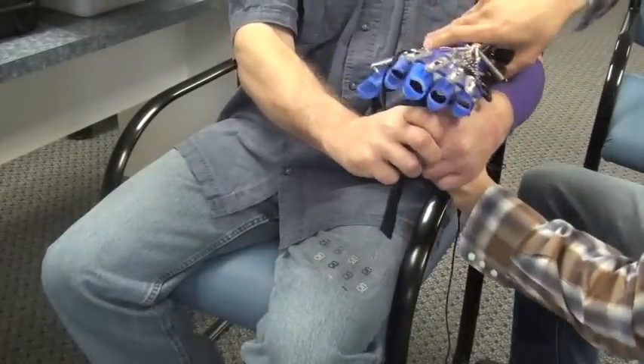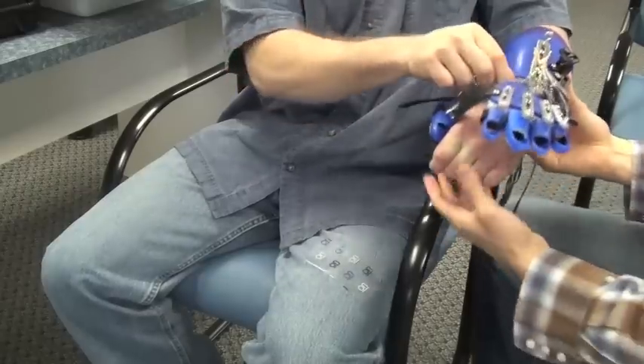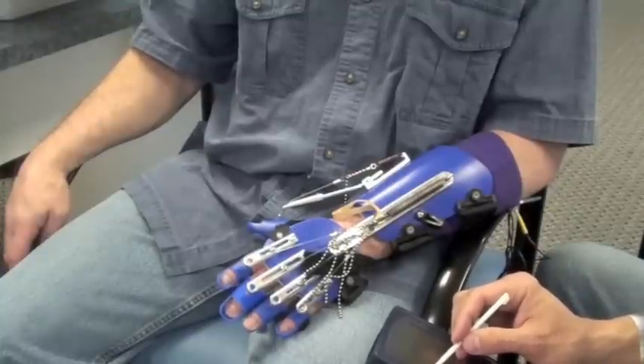Now you're going to apply the SaboFlex over the Coban wrap. Be careful not to shift the electrodes when applying the forearm shell. Turn the electrical stimulation back on for the wrist and finger extensors now that the SaboFlex is on.